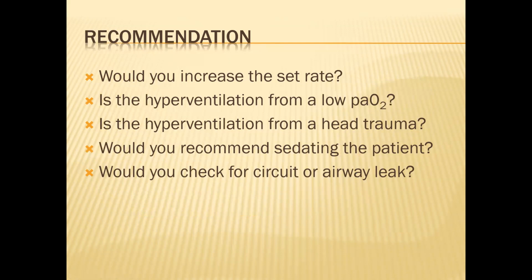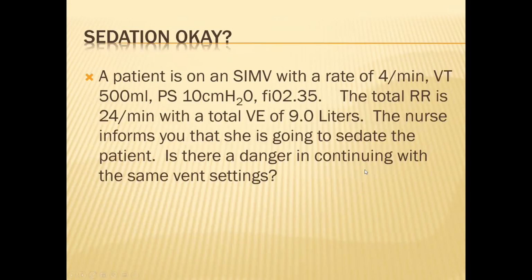Would you check the circuit or airway for leaks? Yes, we talked about that. Patients on SIMV with a rate of 4. So they've been weaned down to a rate of 4. They're probably ready for extubation.